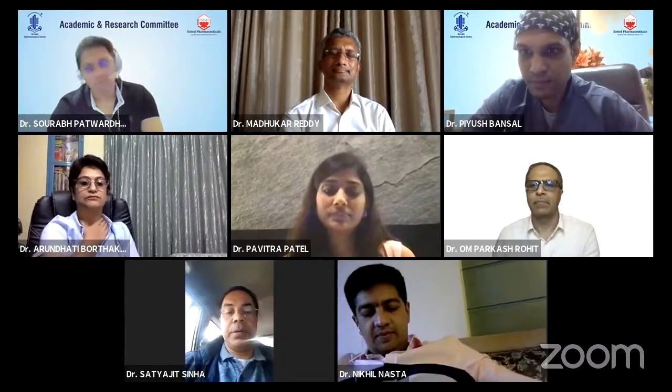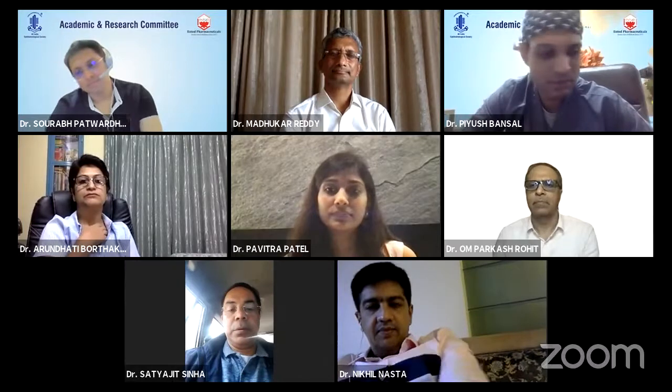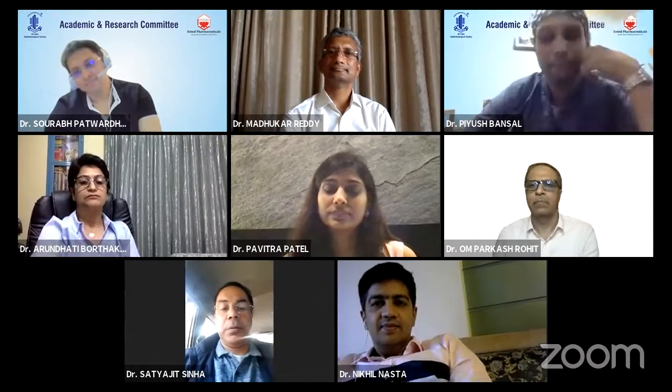And the other comment I wanted from the expert panel, Dr. Madhukar, I believe Dr. Rohit Om Prakash is also there, and Dr. Saurabh. What would be your comment for placing the 3-piece IOL in the bag versus 3-piece IOL in the sulcus with optic capture?